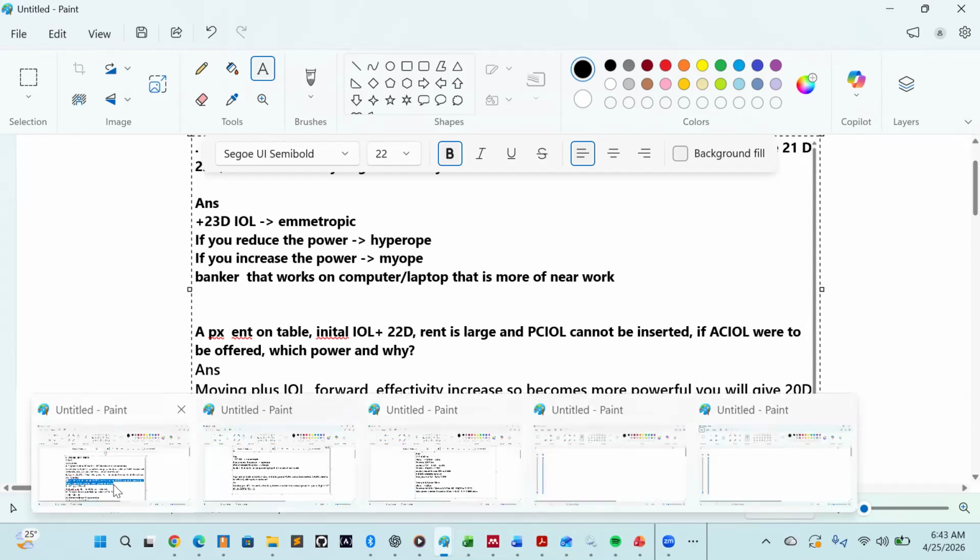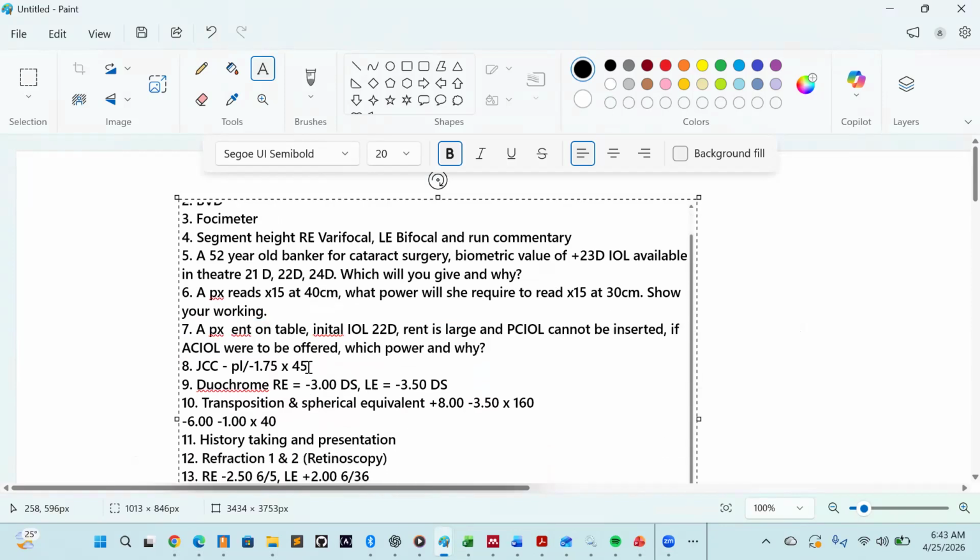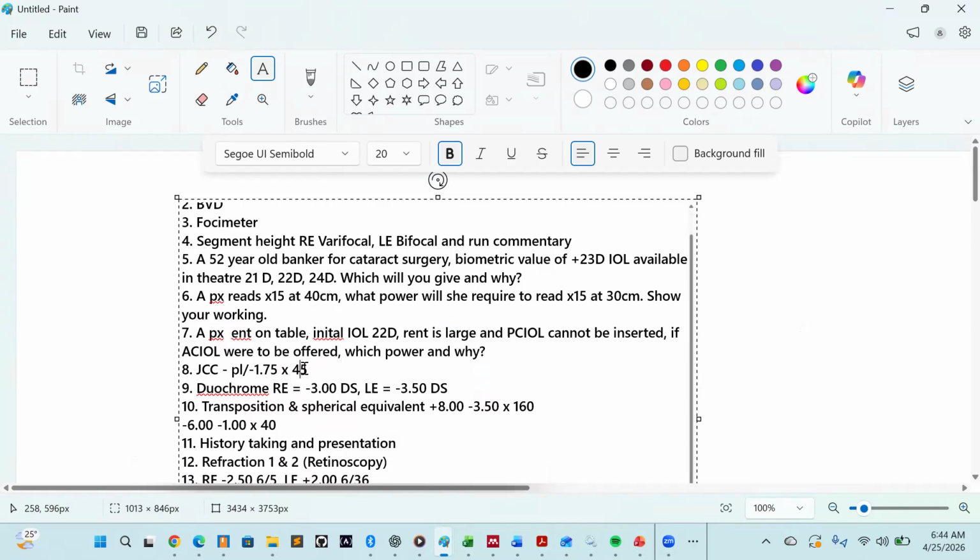Okay, so that's how we do it, but again, watch the video on refraction, you see that. I've explained the procedure, and then the marks we get: the entry VA, where you determine the axis, before the power, you find the axis, you find the power for every cylinder. So you usually pick the slight lower one.